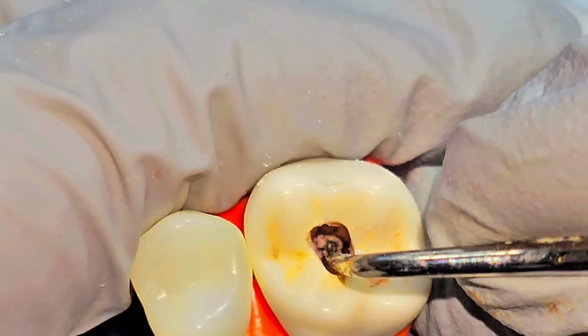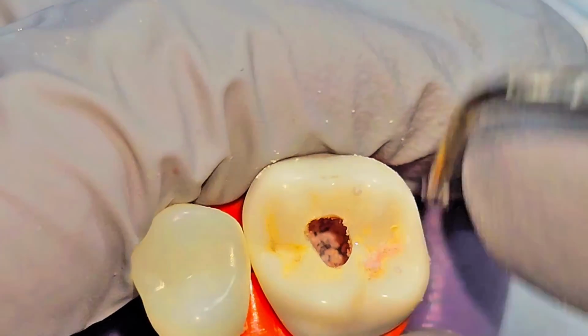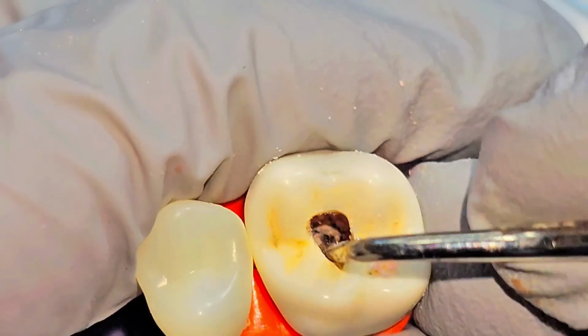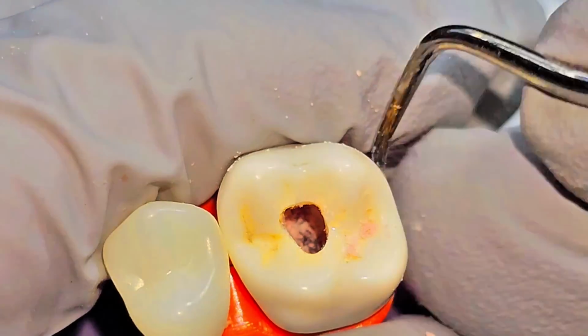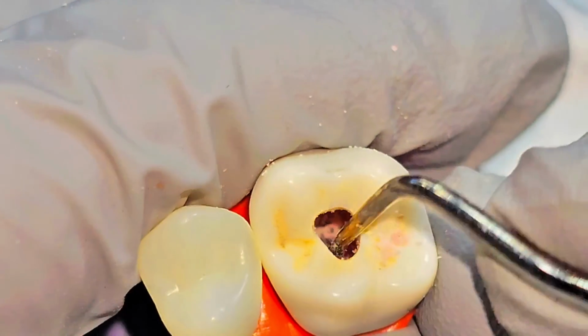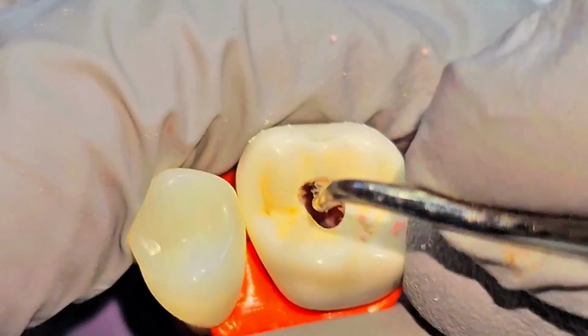Now we begin to see the clean pulp floor. I don't know whether it is allowed to blow the three-way syringe, the air syringe here.